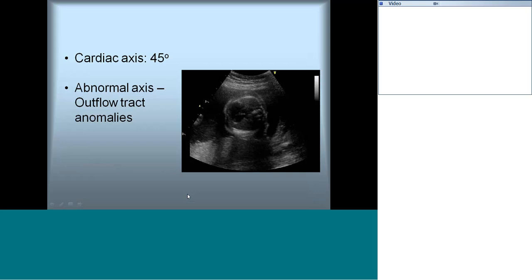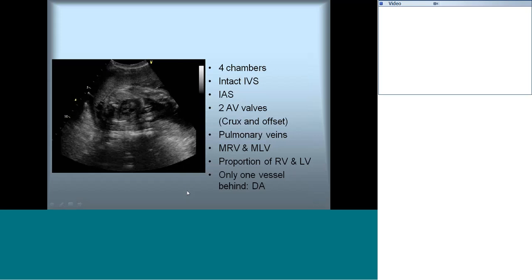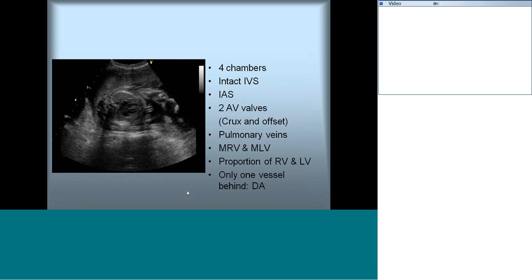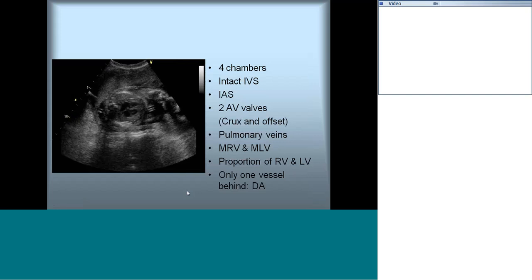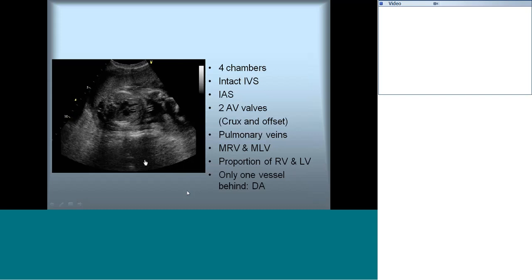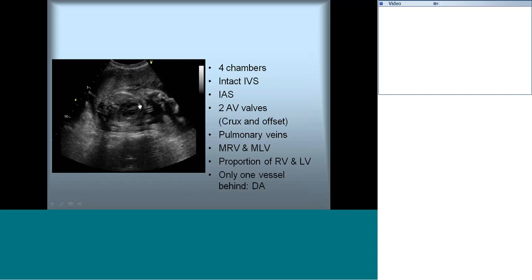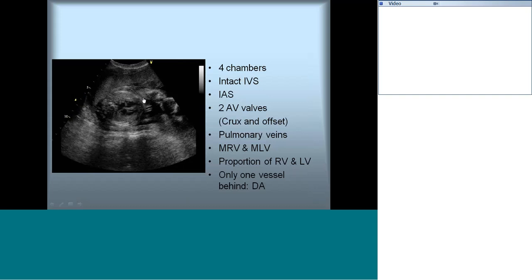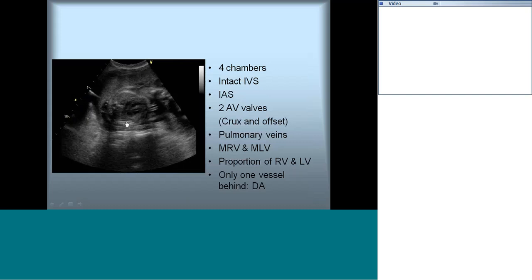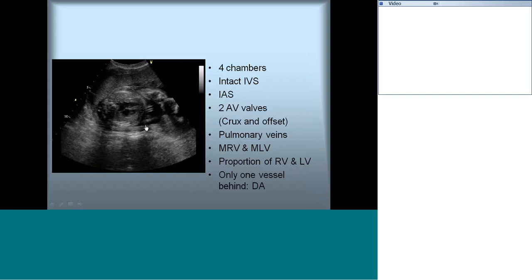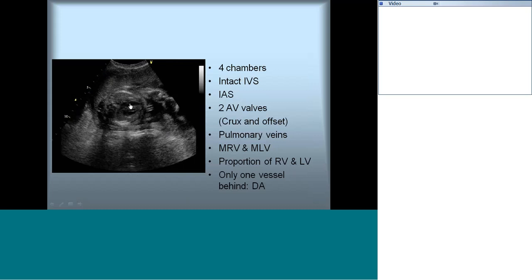Once we are satisfied with the size, position, and cardiac axis, we proceed further for detailed analysis. During this study we also make sure that the stomach bubble is on the left, the apex is on the left, and the descending aorta is on the left. The liver is on the right. In the same cross section used for determining sidedness, we get a view very similar to the four-chamber view.